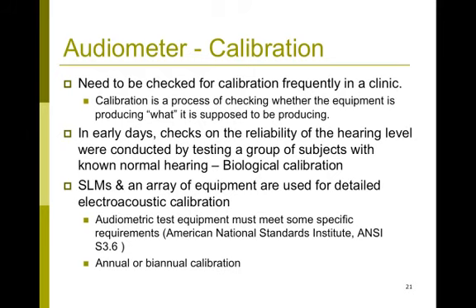But annually or biannually, you would also have to do a detailed electroacoustic calibration to make sure that our testing equipment meets specific national standards. The ones that we follow over here are the American National Standards Institute standards for audiometry calibration.